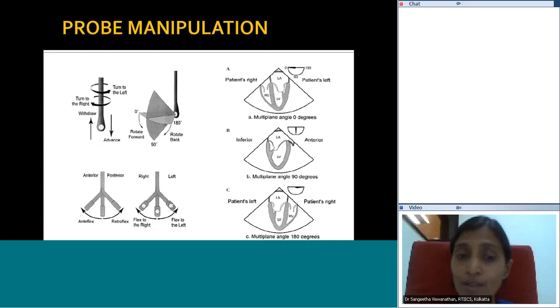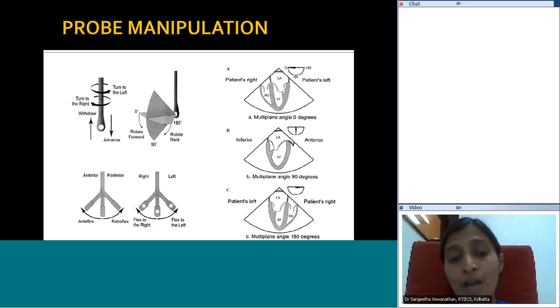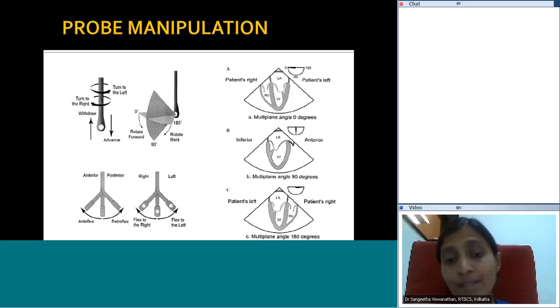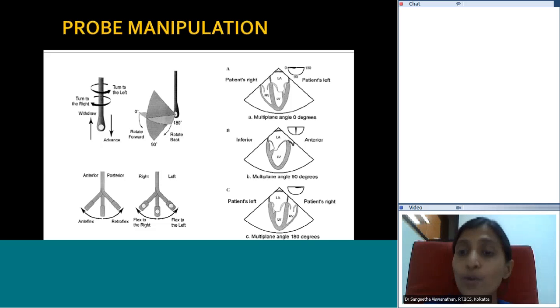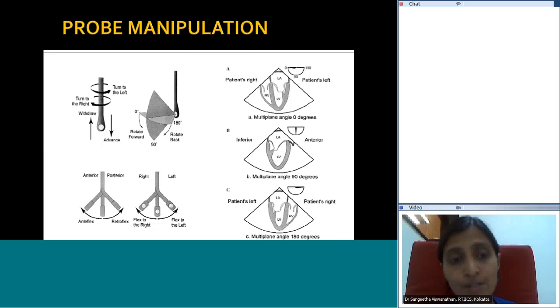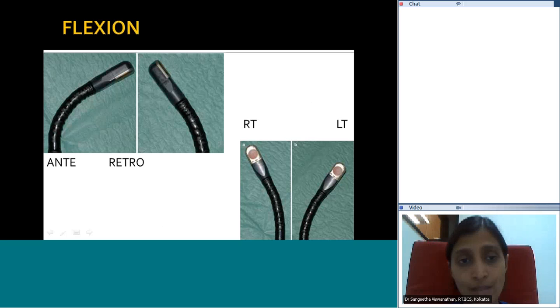There are also flexion maneuvers. The bottom knob allows ante-flexion and retroflexion — bending the probe tip anteriorly or posteriorly. The upper knob allows right and left lateral flexion. So the probe tip can be bent anteriorly (ante-flexion), posteriorly (retroflexion), to the right, or to the left. It is important to practice with the probe in your hands outside of the patient — play with all the knobs to understand how they work before inserting it.